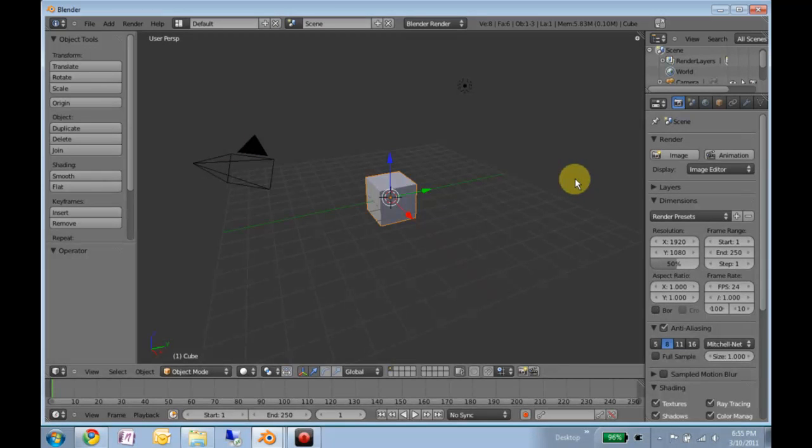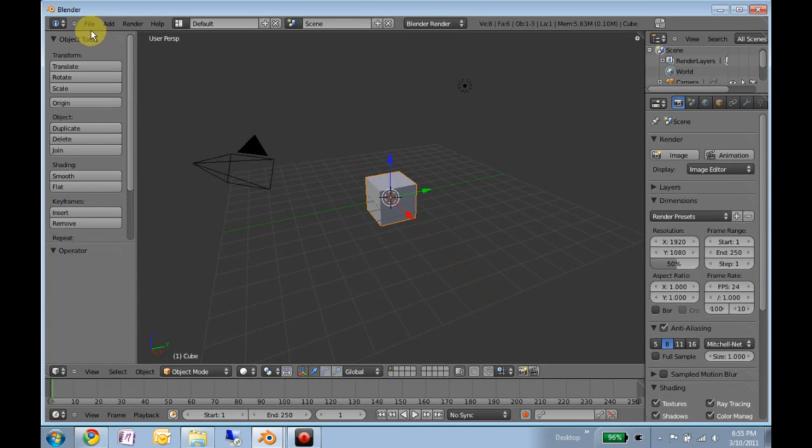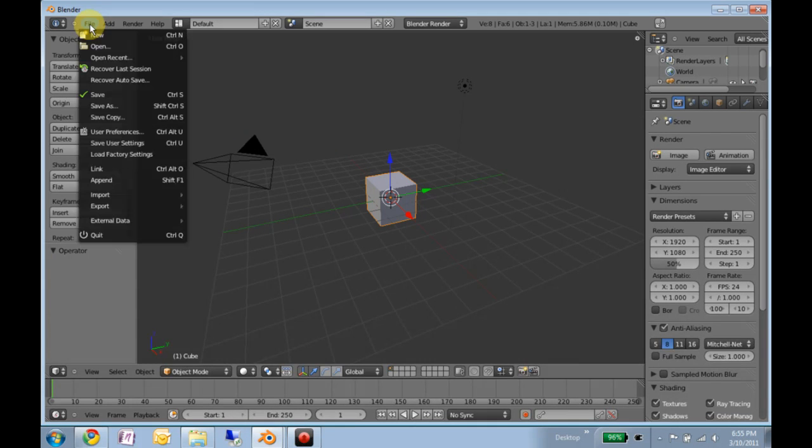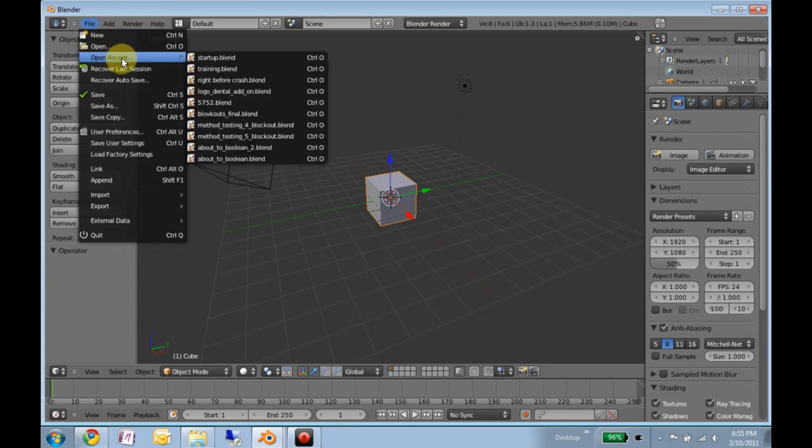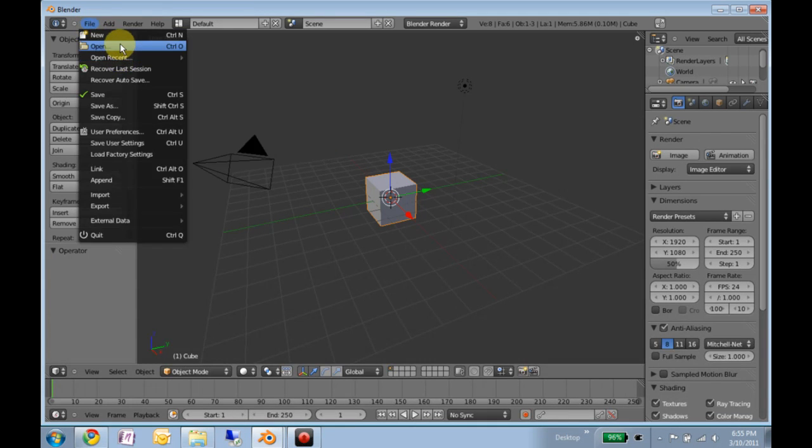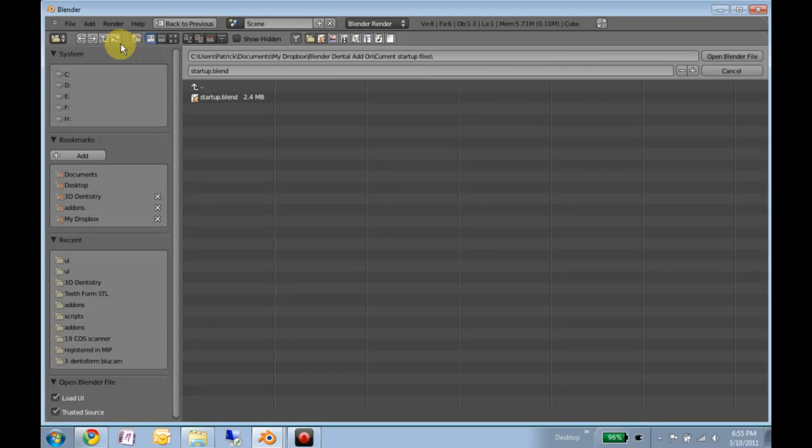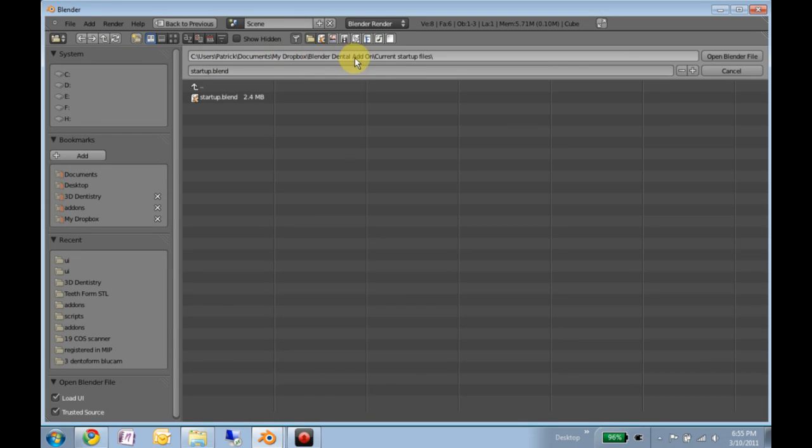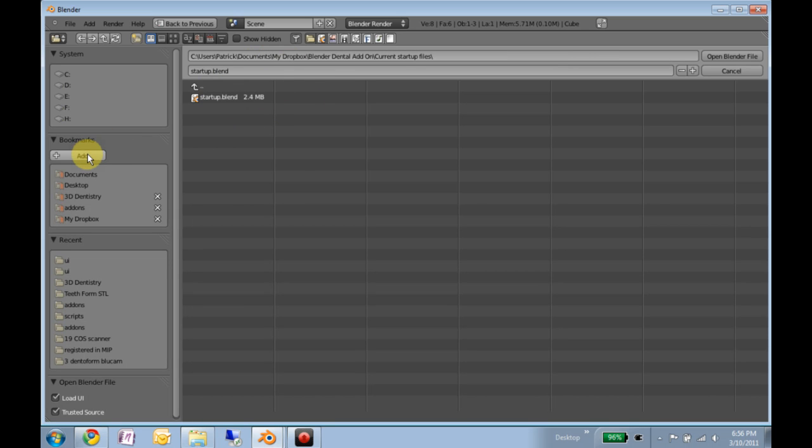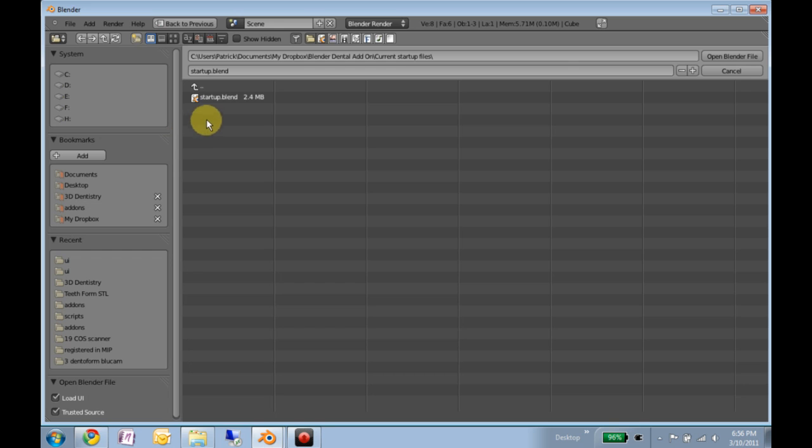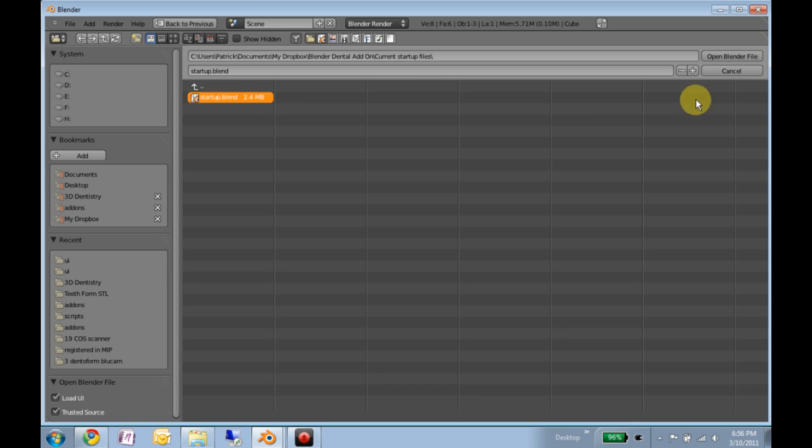So right-click over here. The first thing you'll want to do is open. You'll want to navigate to your Dropbox folder where it has everything. A good idea would be to bookmark that folder. That way it'll always be right here, ready to rock and roll. You'll want to open startup.blend.